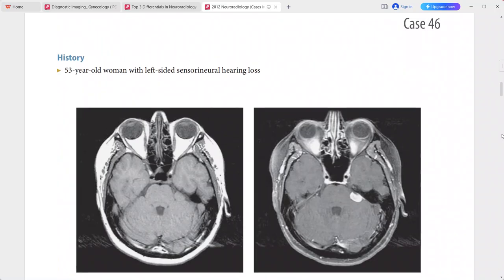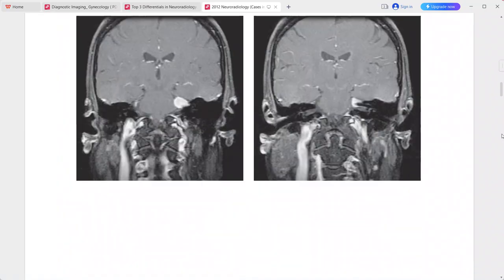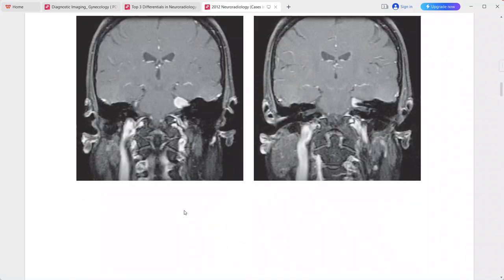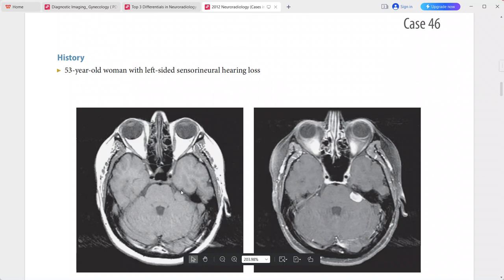Next: a 53-year-old woman presenting with left-sided sensorineural hearing loss. There is an extra-axial mass in the left cerebellopontine angle, centered above the internal auditory canal. It is isointense to white matter on pre-contrast T1 and enhances uniformly on post-contrast.